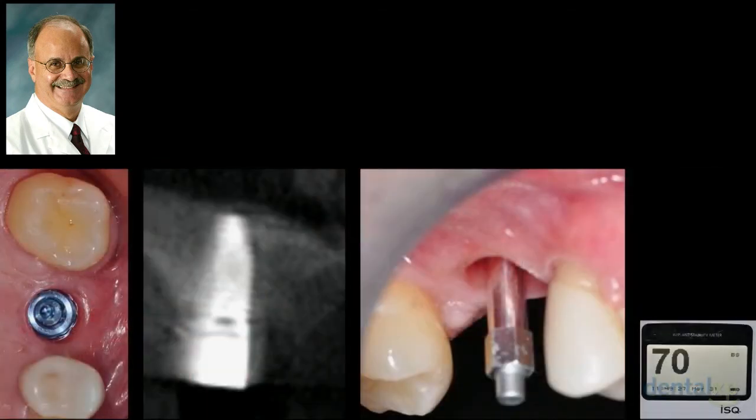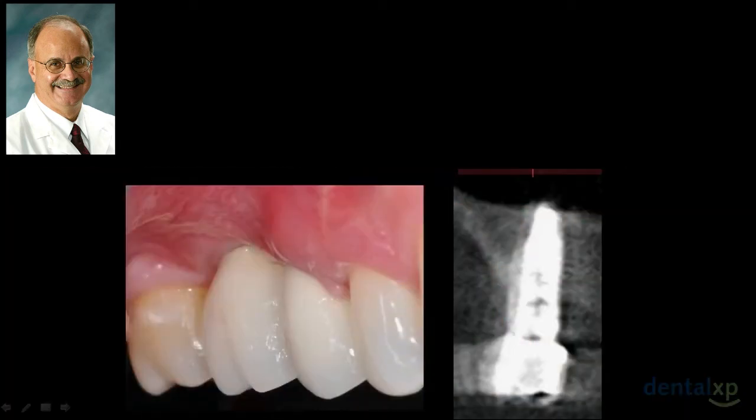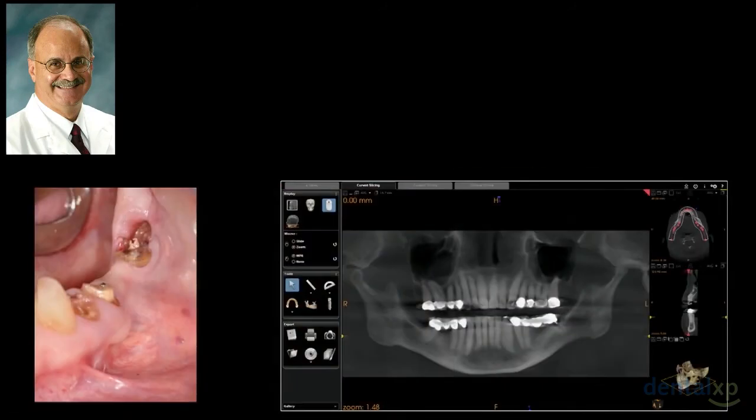And here we're actually using even some small titanium tacks. If you go strictly, purely by what the system is made for, there are the same tacks, if you will, that are made of the same material that breaks down and hydrolyzes without any need for any metal at all. But the key is the mesh itself will hydrolyze and you don't have to re-enter. And I've gotten a number of these cases, and others have so many, to validate this protocol.